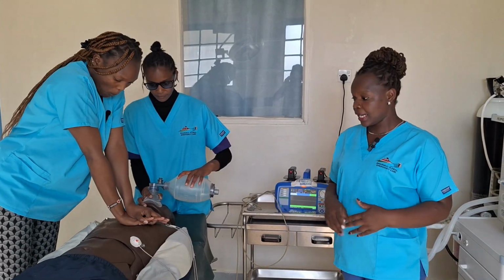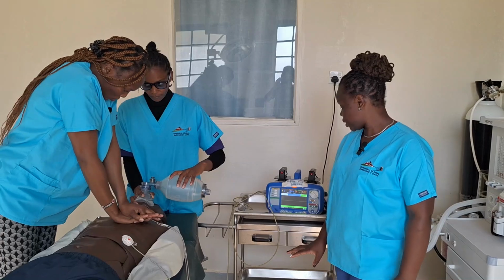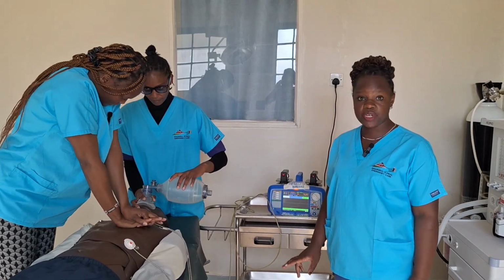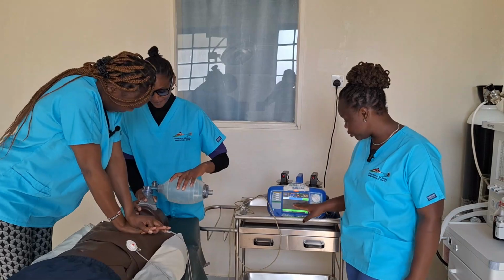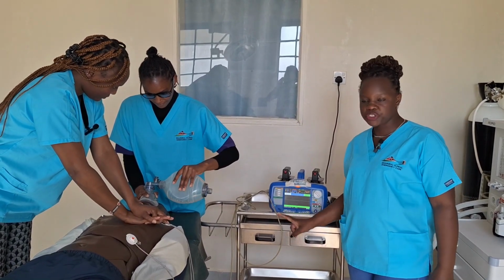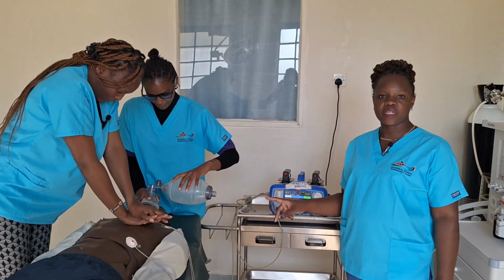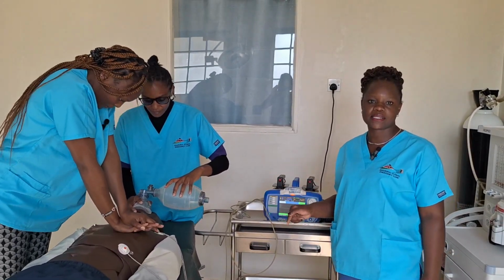To ensure high quality CPR is being provided, we are going to make sure that we have minimal interruption. So when we check for the pulse, I'll also be looking at the monitor for the rhythm. Also, by checking for the pulse, we ensure that we don't shock a patient who has a pulse.